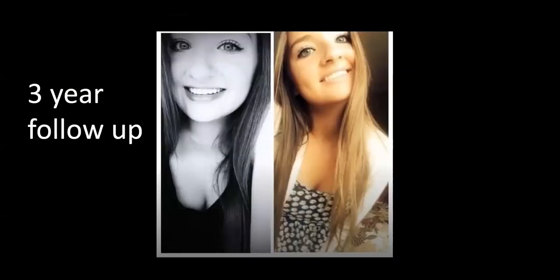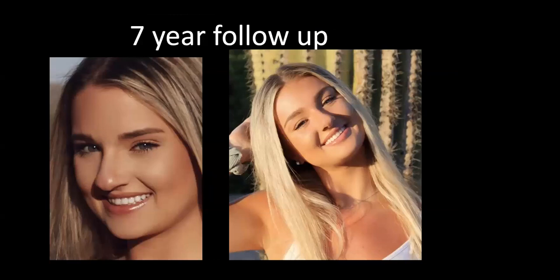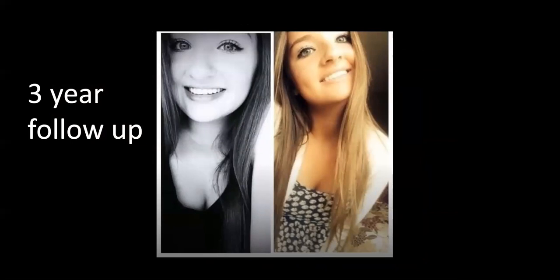We used Filtech Supreme Ultra. We used the white shade. They wanted bright teeth. I usually use B1, but they wanted white, so it's a little bit brighter than I sometimes do. So these teeth feel smooth and healthy and strong. I'm curious to see what everyone thinks of the aesthetic of the case, or if people have questions about matrix selection or anything else about the case. We're going to show you how to do this in just a minute. So let's open this up for questions real quickly about the twins.